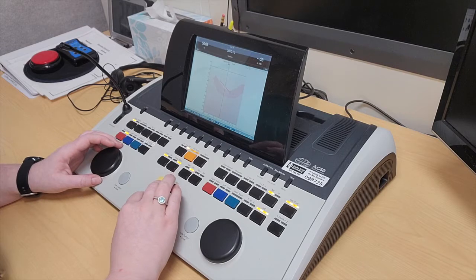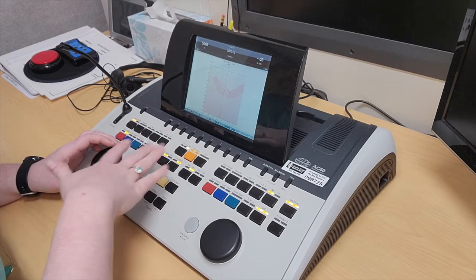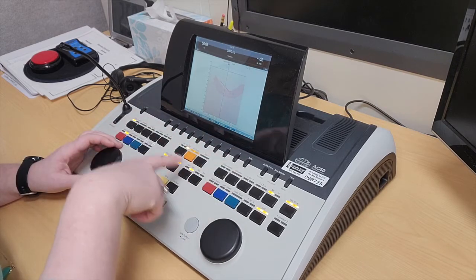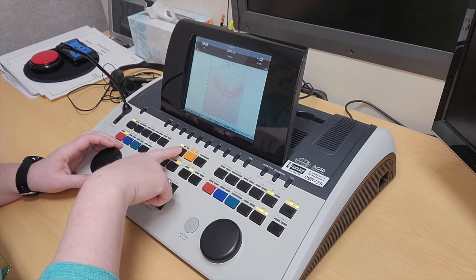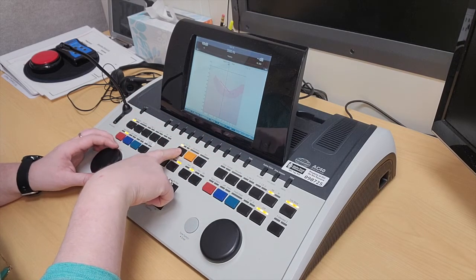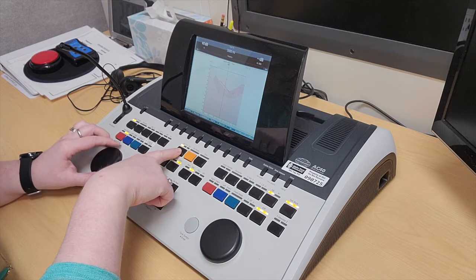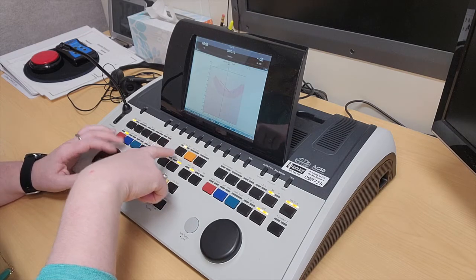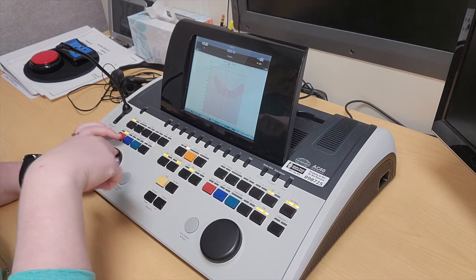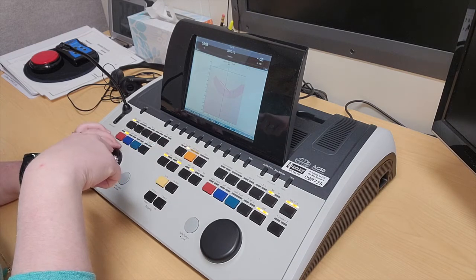If I wanted to change the increment level, right now it's on 5 dB. I could click here for 1 dB or 2 dB, but we like it at 5 dB.